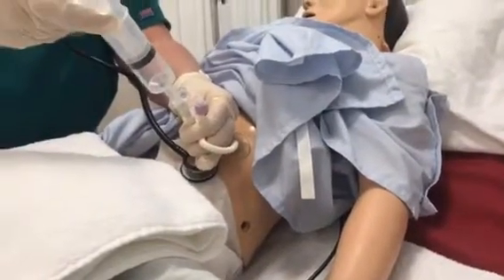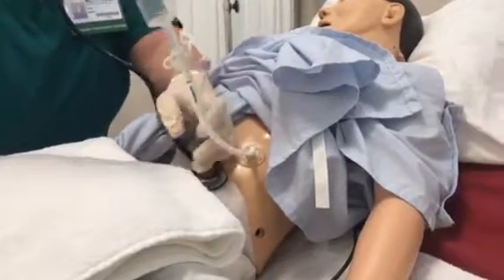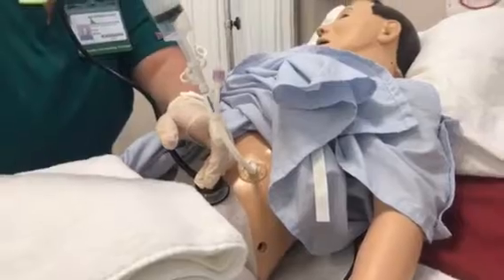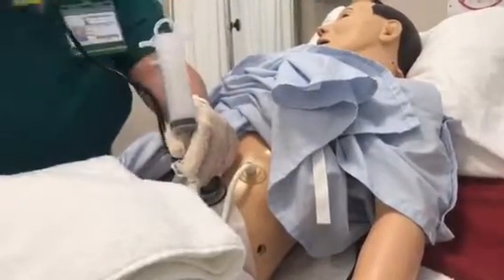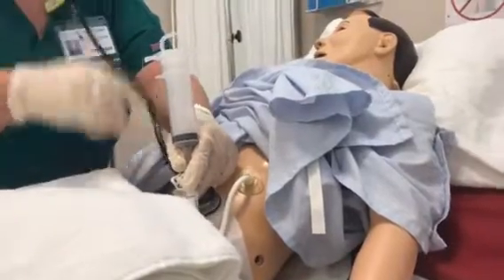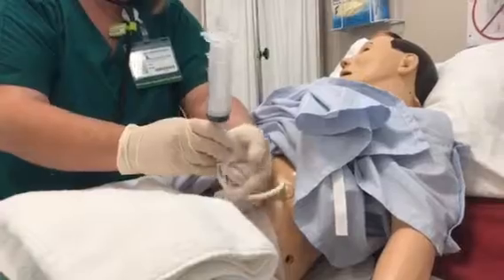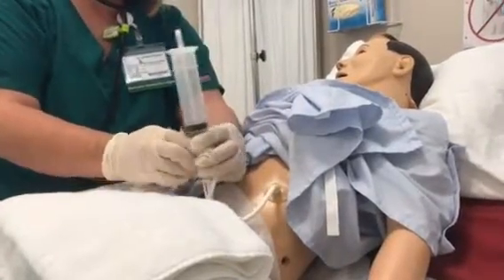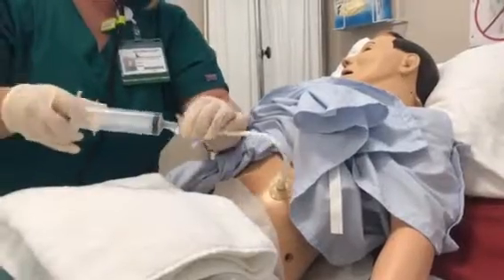So I'm going to slowly administer 30 mLs of air. And I did hear the swoosh, so that's good. We're in good placement. Okay, so now I'm going to pull back residual until I meet resistance.